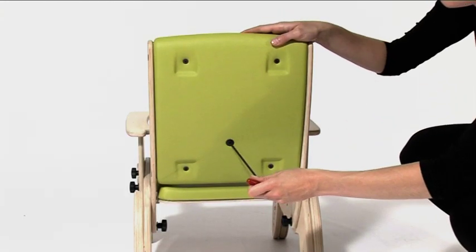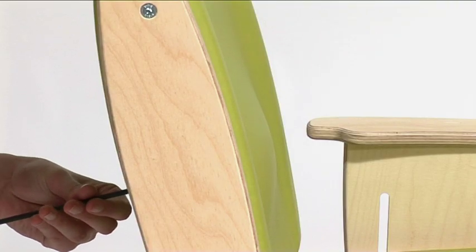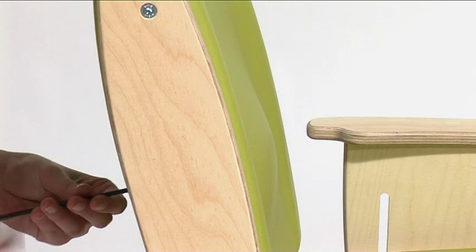To adjust the lumbar prompt, insert the hex head tool into the rear of the Junie seat back and rotate to achieve the desired amount of prompt.